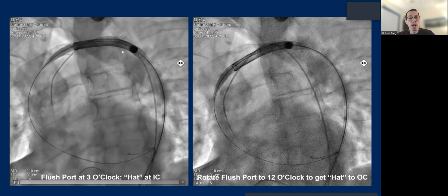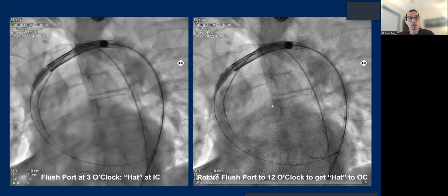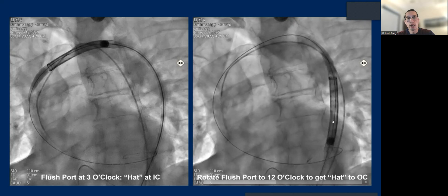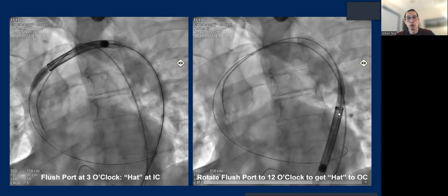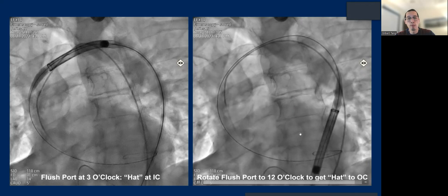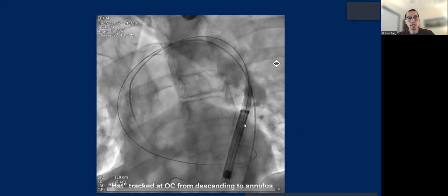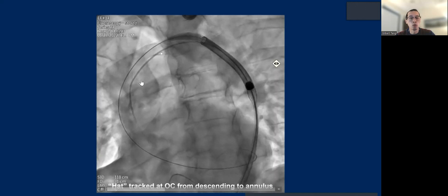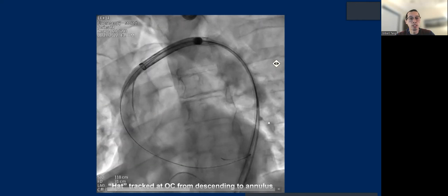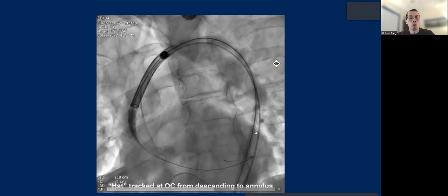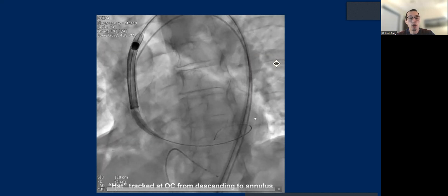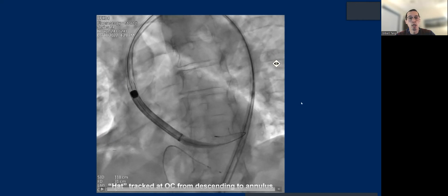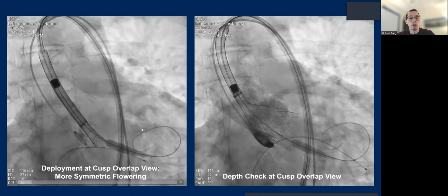We had to bring this back to the descending aorta and rotate the catheter to optimize commissural alignment — something we no longer need to do. We just automatically adjust at the descending aorta: by rotating the catheter, we rotate the hat marker to the outer curve. Then when you track the hat marker and delivery system, it maintains at the outer curve. Now we just look at the descending aorta — if the hat marker is in the outer curve or centered, you can quickly track across the arch and ascending to the annulus, and the hat marker will be in the optimal orientation.